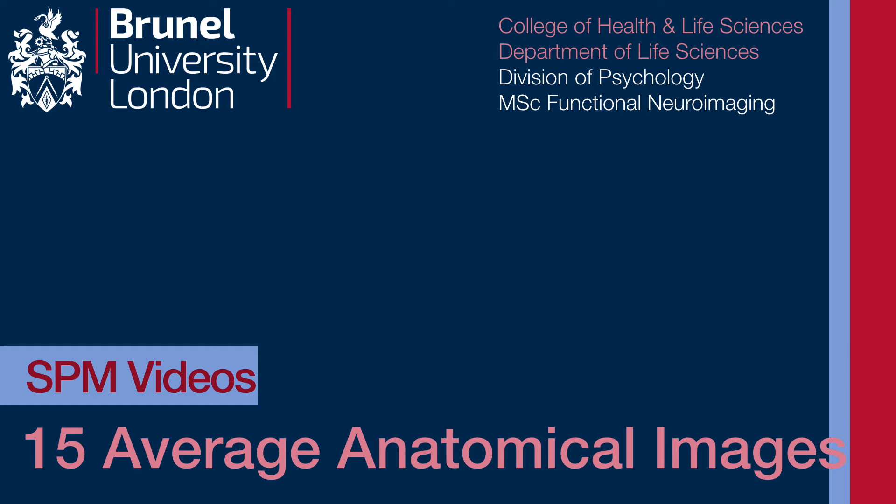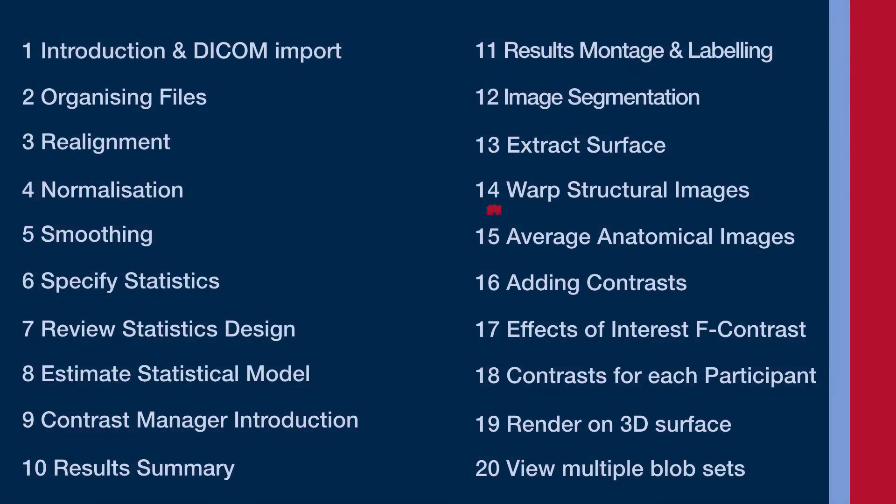Video 15 is about calculating the mean or average of different structural anatomical images once they've been normalized. This step is not actually necessary, but it's interesting to do for two reasons.